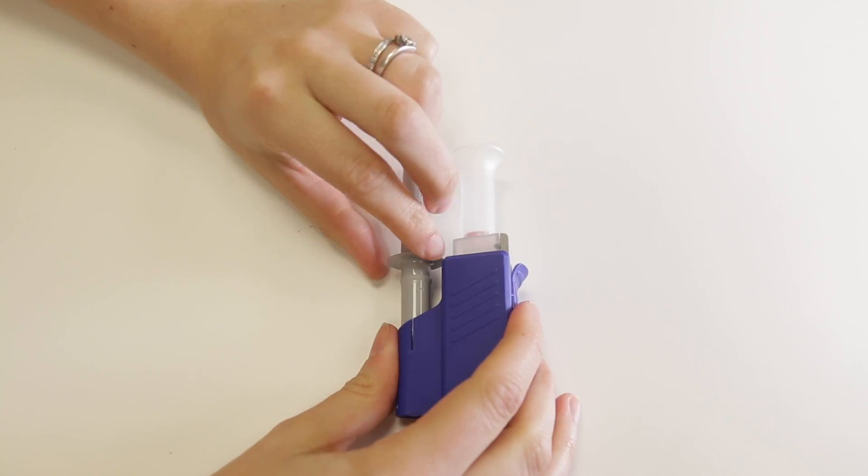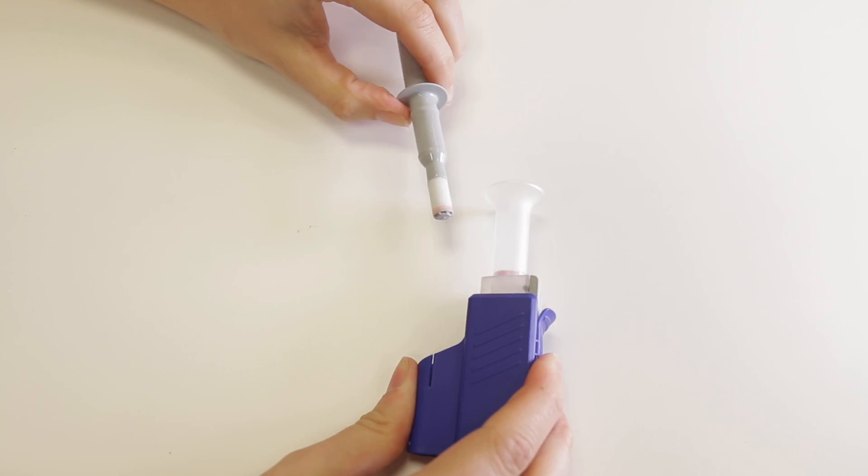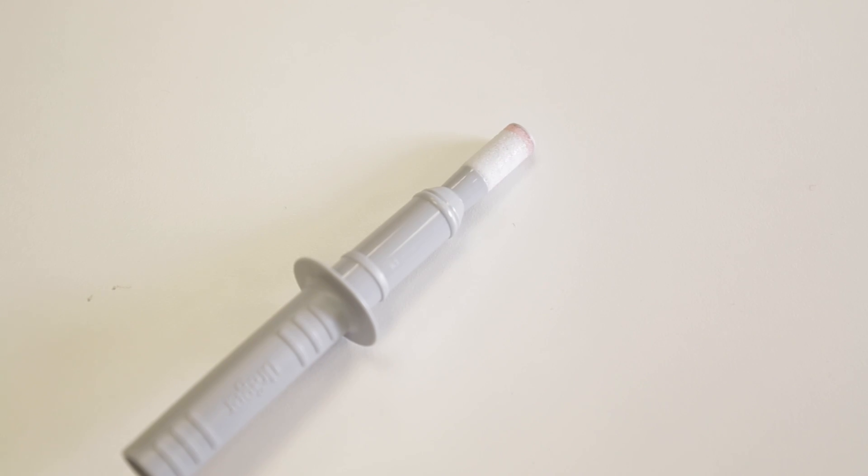Now remove the sampler from the cassette and you'll notice a colored ring around the sampler, which will be used to indicate that a sample has been taken.